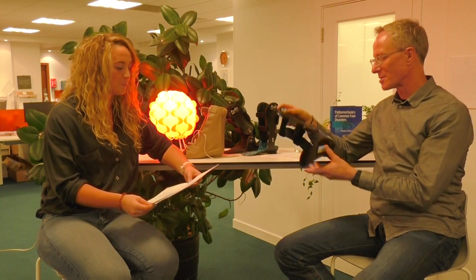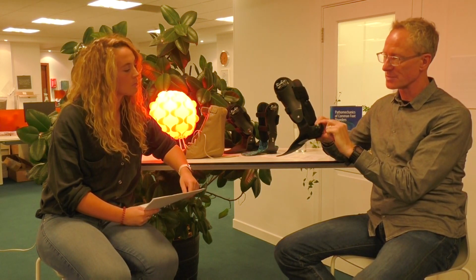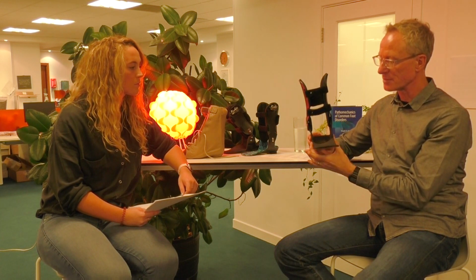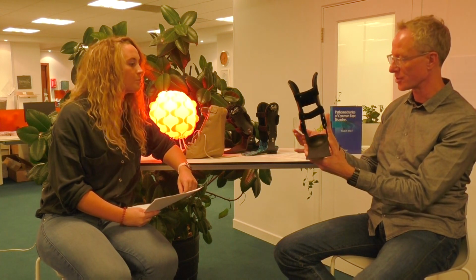And then, as you touched on some of it already, what makes up a Richie brace? Like, the different components. Yeah, well, the main thing that you're going to see is a 35mm heel cup. So it's a very, very deep heel cup. The deeper the heel cup, the slightly wider the product. So you have this wide foot plate, so you get more ground reaction through the foot plate onto the foot. The deep heel cup also adds a degree of contact and support control.